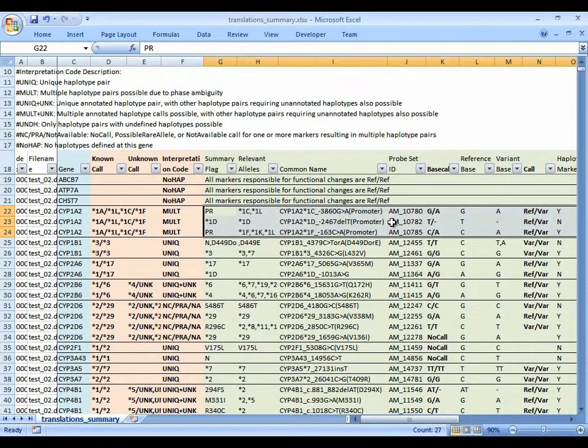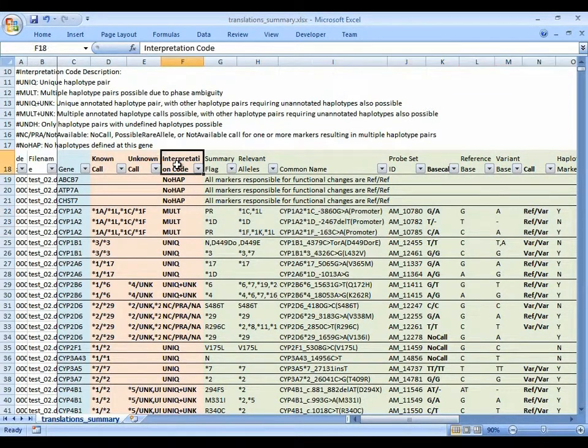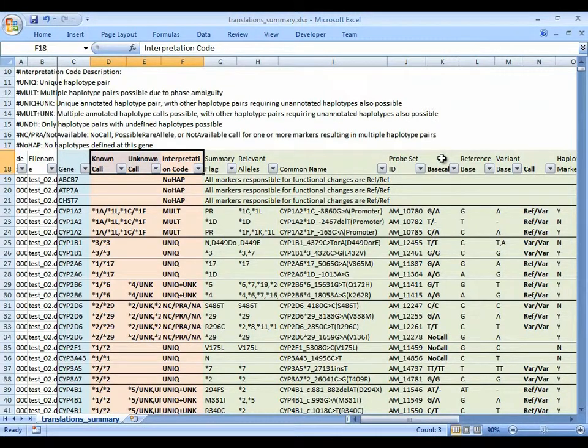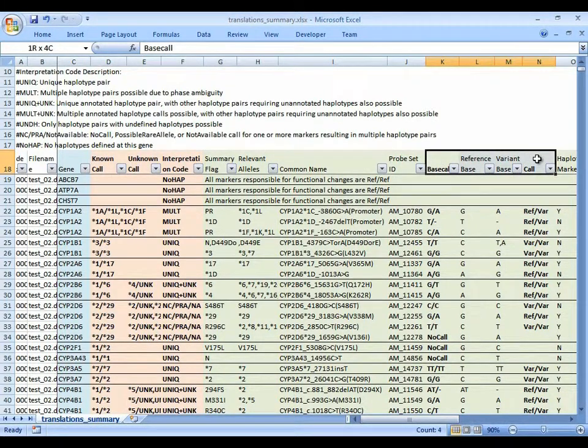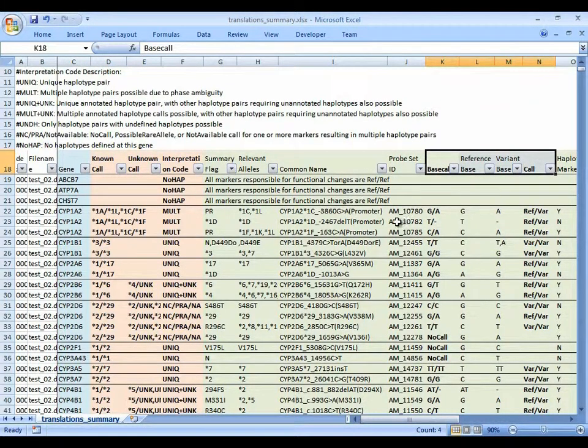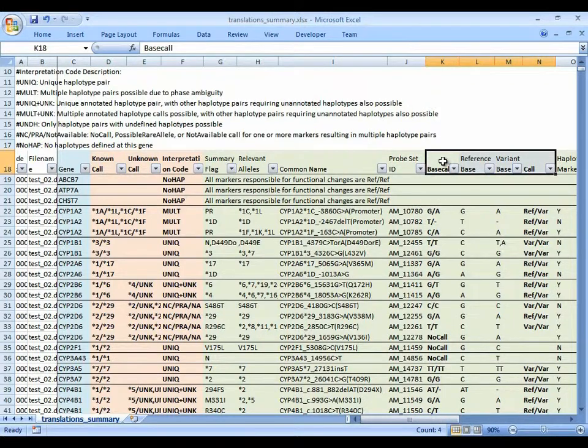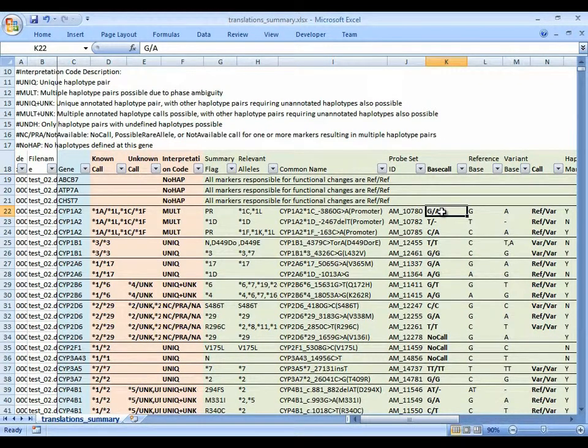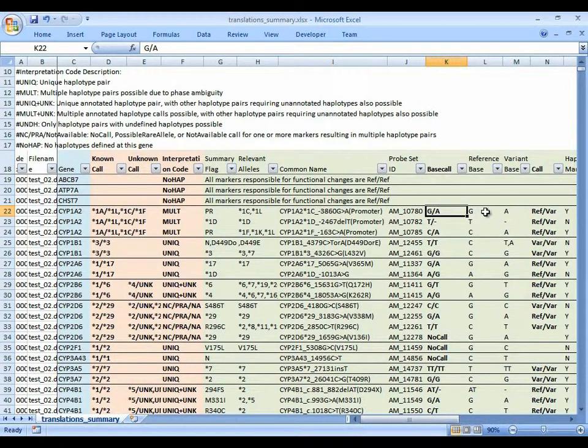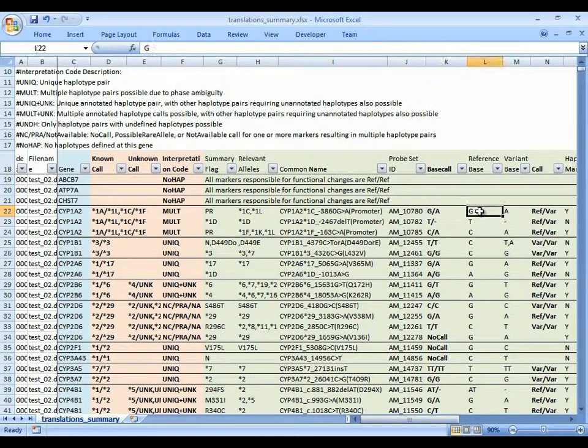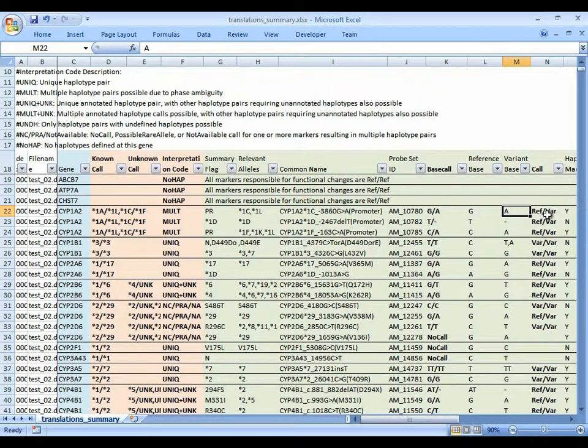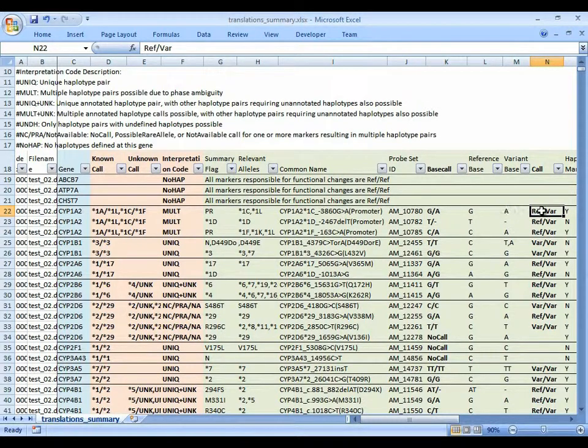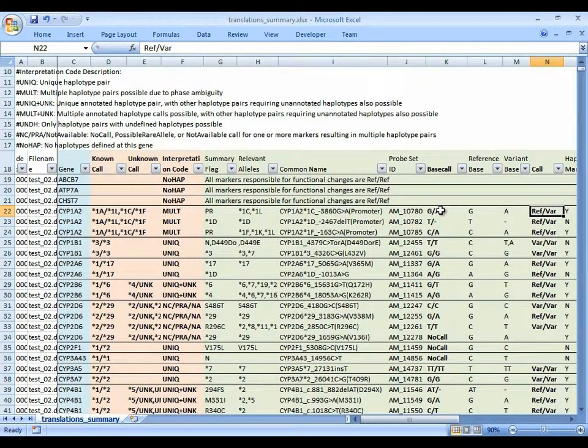So let's start with the base calls. Everything in boldface is data. Things that aren't in boldface is reference information. So starting with the base call, G to A, the translation table identifies which is the reference base, which is the variant base, and uses that to make a reference or variant call. So in this case, we have a combination of a reference call and a variant call.